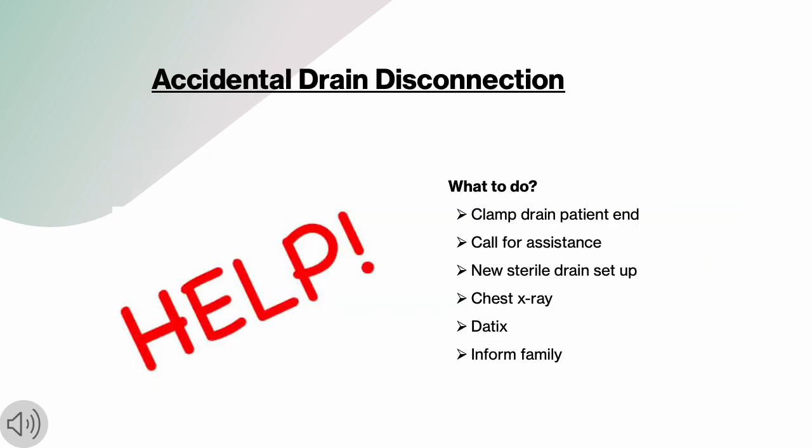The final slide of this presentation will look at what to do should a drain become accidentally disconnected. Firstly, the drain should be clamped at the patient end, closest to the patient, as quickly as possible. A medic should be alerted and help should be called for. A new sterile drain should be set up as per protocol and attached to the chest drain. Once attached, the clamps may be removed.